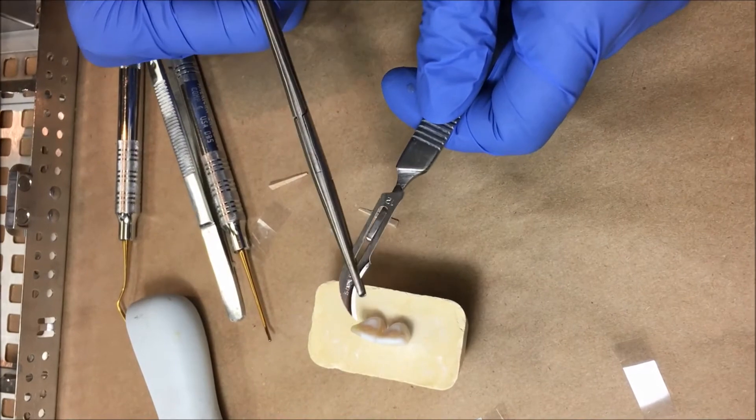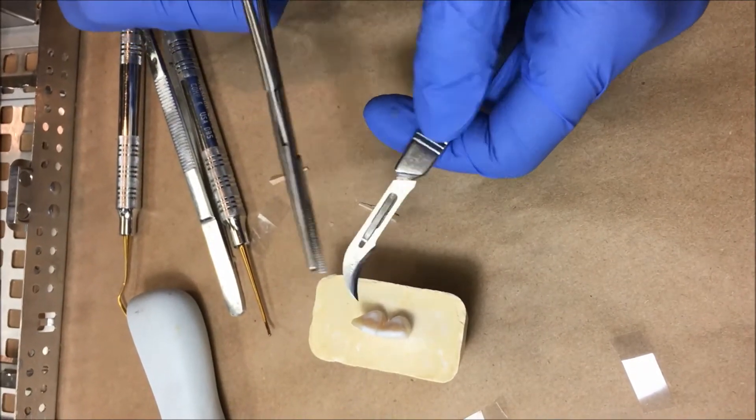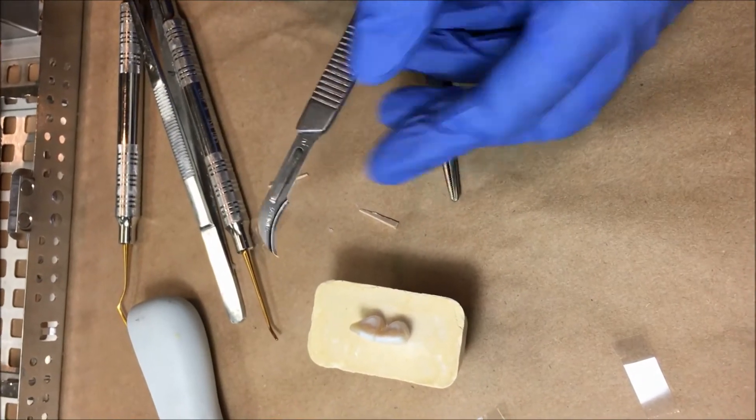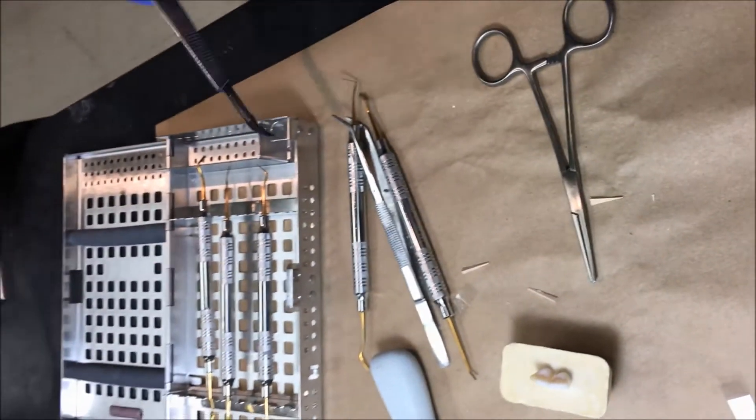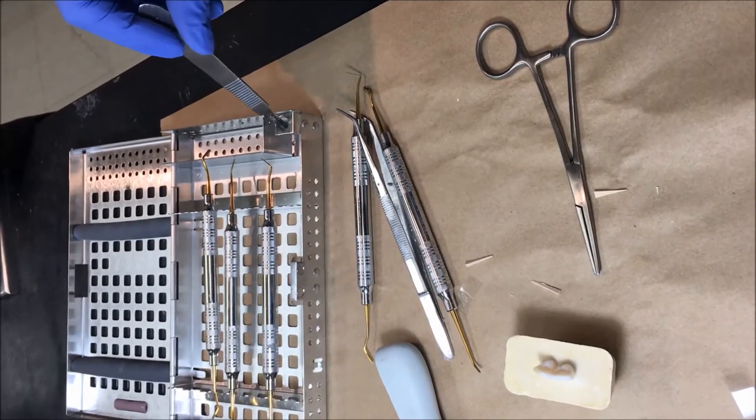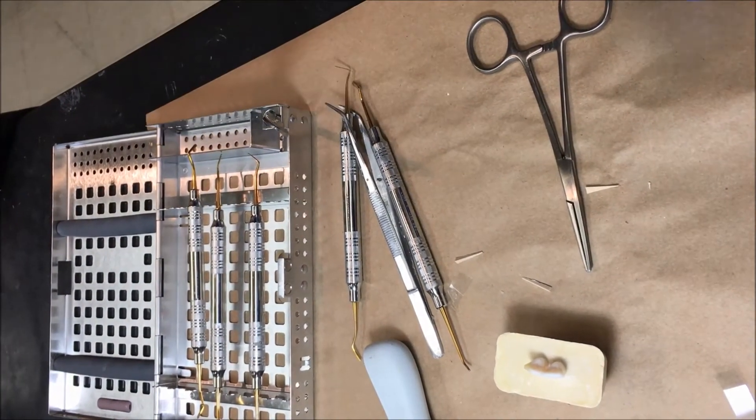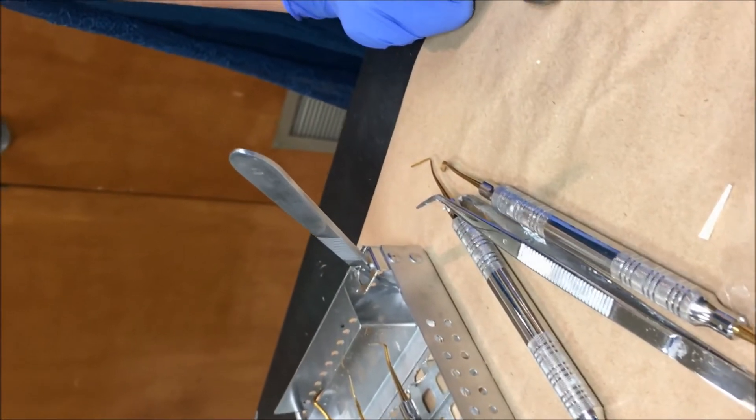Okay one of the things that's one of our biggest pet peeves is if we come over and your whole area is messy. I kind of want to know where that scalpel blade's at. There's a nice little area right here in your composite kit that that blade can sit in there safely and no one's going to get stuck with it hopefully.